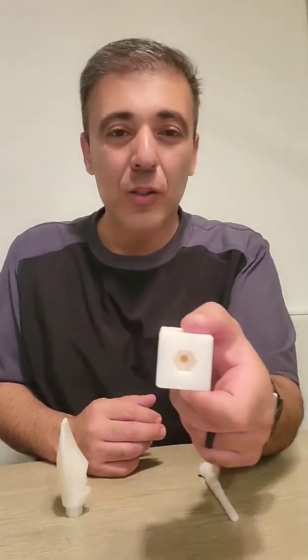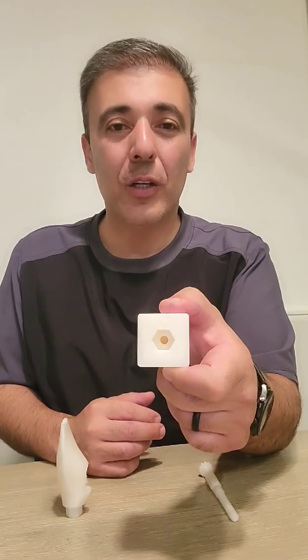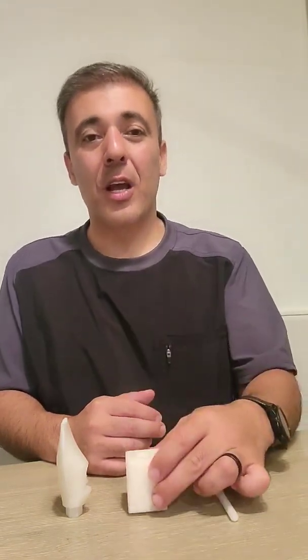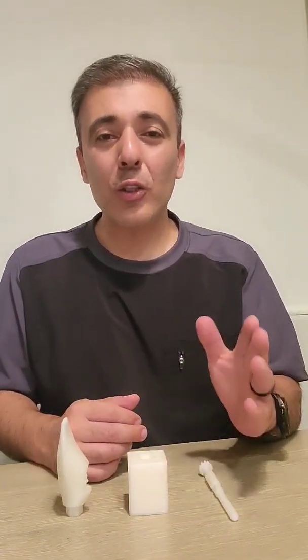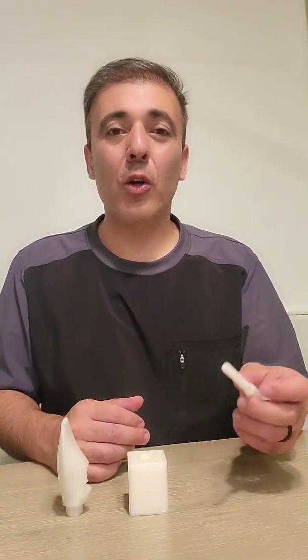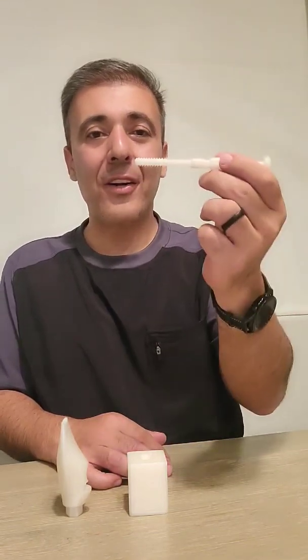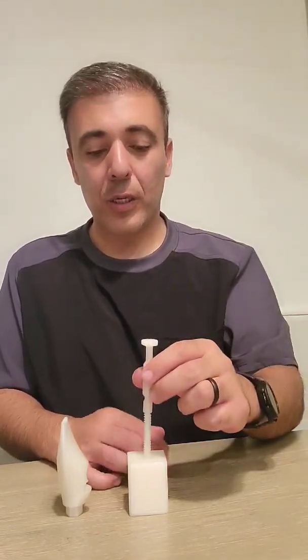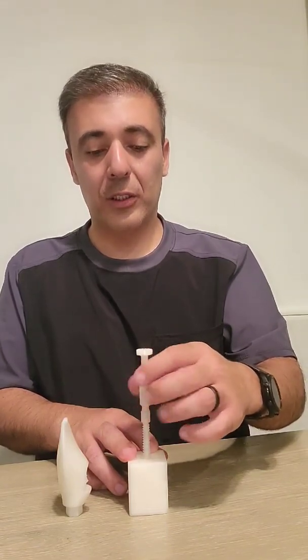Imagine this to be an implant — it will use a hex internal connection for this demonstration. However, this system can be adapted to all connections. In order to prevent aspiration of small components in the oral cavity, a driver will carry the shank to the implant and thread it down until a full seat is achieved.